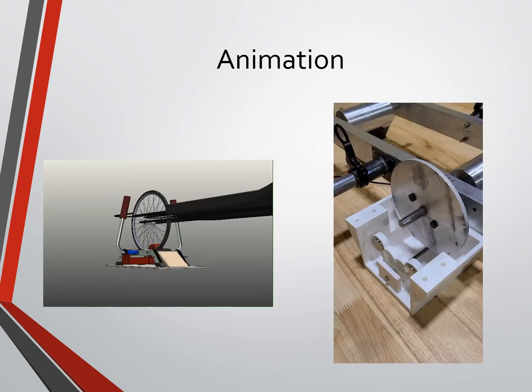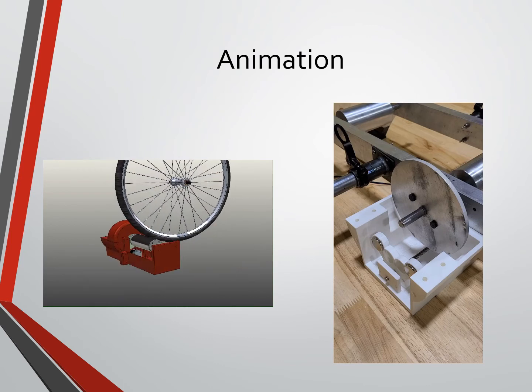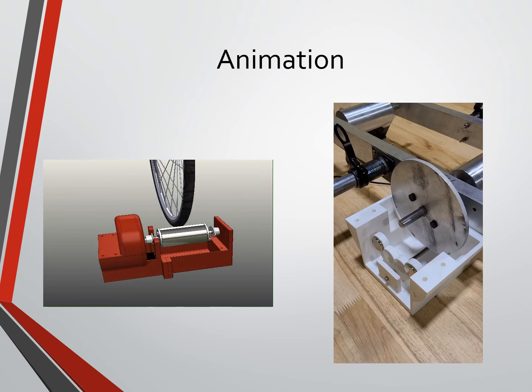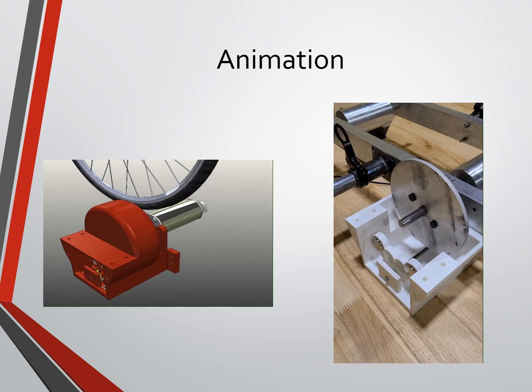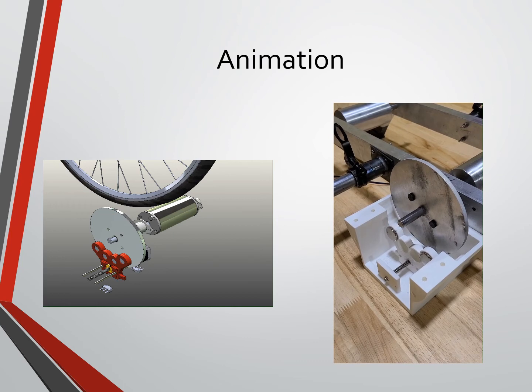To address the dynamic resistance need, we implemented an eddy current brake to the system. We can control this resistance with a stepper motor that is attached to a series of magnets that can be moved closer to or further away from the flywheel. The flywheel that spins during operation generates a resistive torque when in the presence of a magnetic field. As the magnets move closer to the flywheel, the resistive torque increases and the resistance on the rider increases, giving them a harder ride. As the magnets move further away, the resistance lessens.